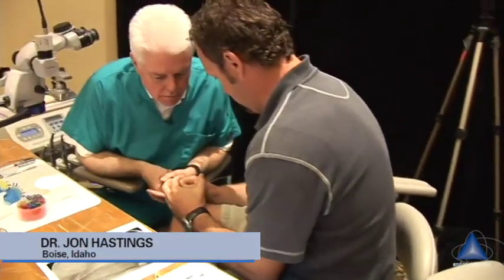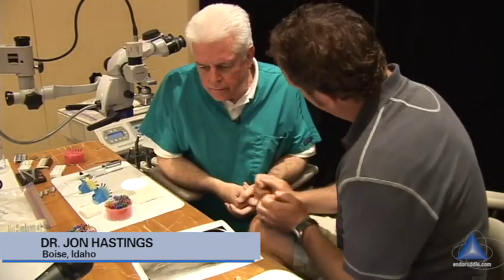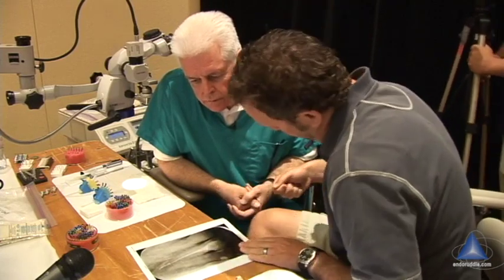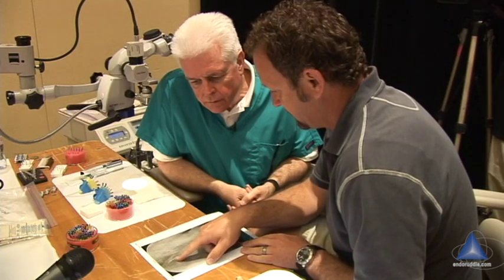If you've got a large diameter at the foramen, how do you keep sealer from going out the end? Because I get the cone, I butter the cone, and I kind of gently seed it in there, but I always get this squirted out. See the sealer out there?